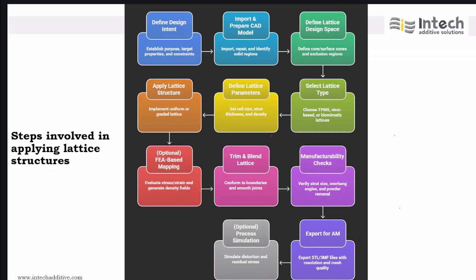And the last step is, once all this is done and thoroughly checked, we can export it for the additive manufacturing process. You can export it as STL or 3MF files with the right resolution and mesh quality.